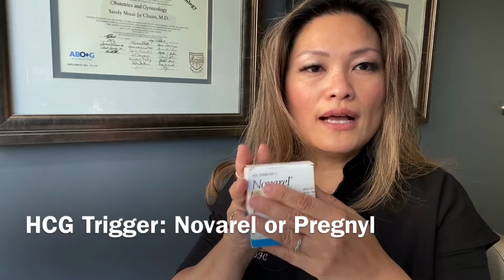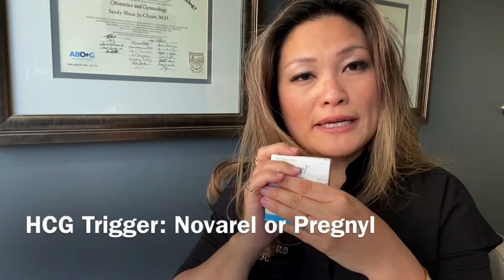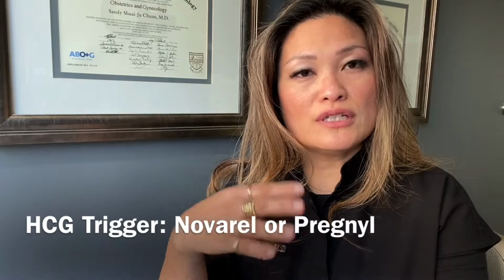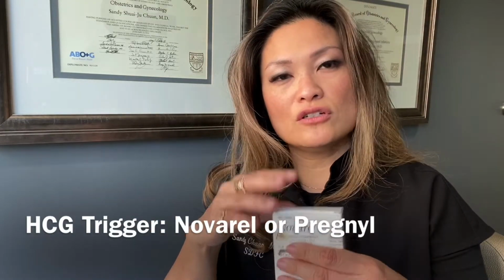And so Ovidrel is a very common one. Here's a box that looks like Ovidrel, and this is a single-use injection, pre-filled, very easy. There's also something called Novarel, and I don't have a box for the other kind of equivalent called Pregnyl, but that's also a common one. And these are HCG hormones. And so Ovidrel is recombinant HCG hormone, and then you have these which are purified HCG hormone, which are all used to trigger ovulation.